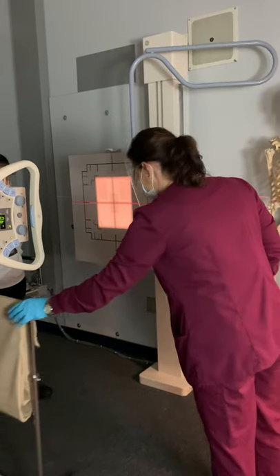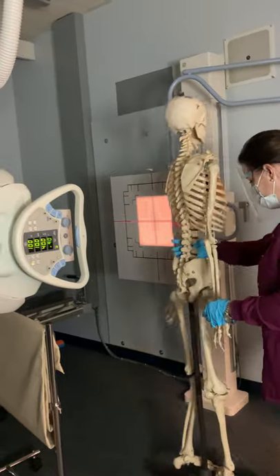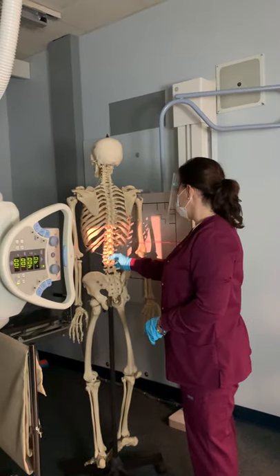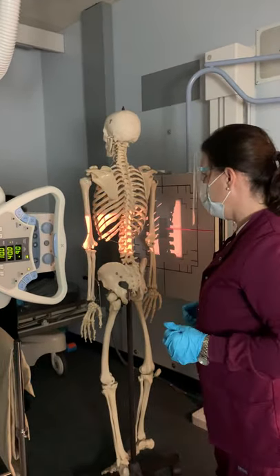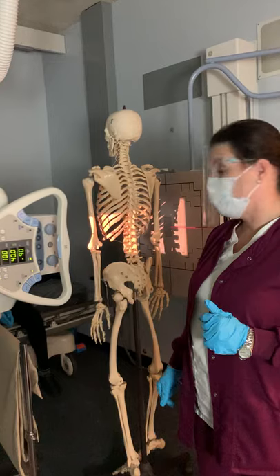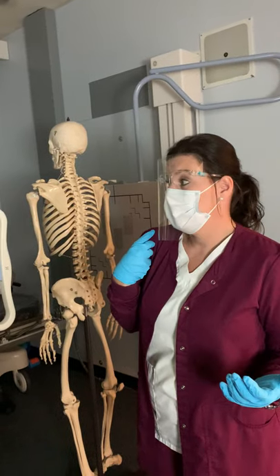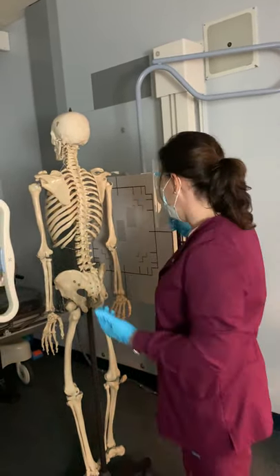I'm going to show you this with a skeleton, then bring the patient back. Remember that the scapula is not straight across the back — it's angled. What we're trying to do here is look for dislocations. It's very common for people to throw their shoulder out of joint — that's dislocating their shoulder. The shoulder can dislocate anteriorly or posteriorly, so we do a scapula projection to look for that.